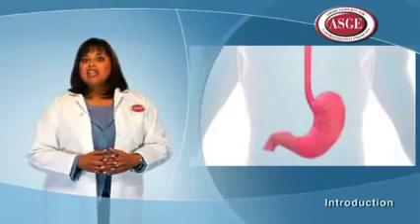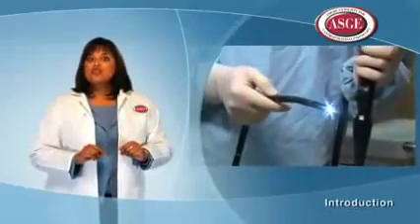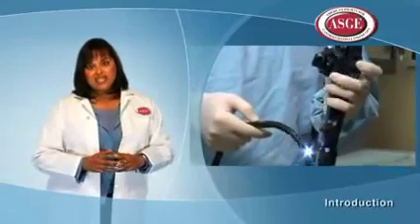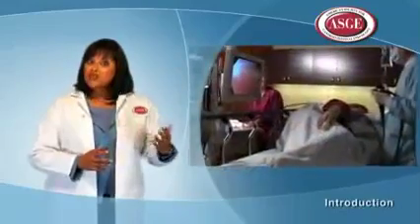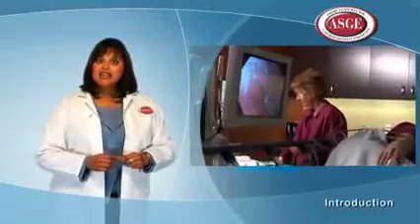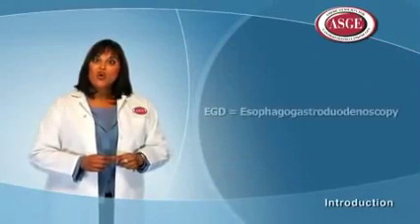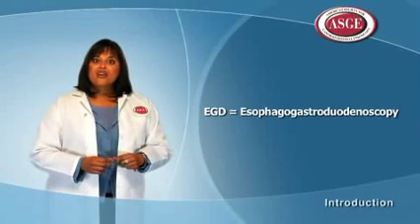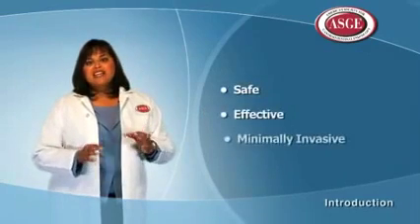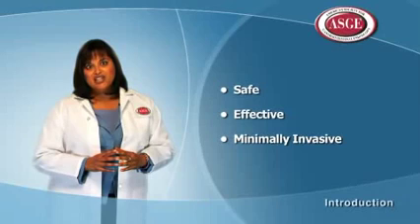During an upper endoscopy, the doctor uses an endoscope. An endoscope is a thin, flexible tube with a small camera and a light on the end that allows the doctor to see inside the gastrointestinal tract. Pictures are transferred from the endoscope to a TV screen that your doctor watches to find abnormalities. This procedure is referred to as upper GI endoscopy, or EGD, which stands for esophago-gastroduodenoscopy. Upper endoscopy provides a safe, effective, minimally invasive way to see inside the upper GI tract.